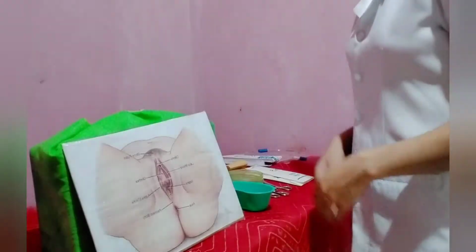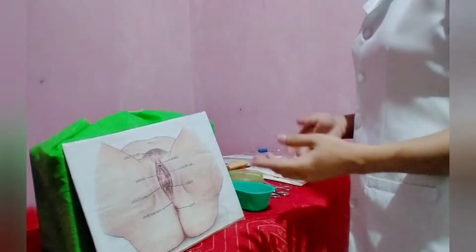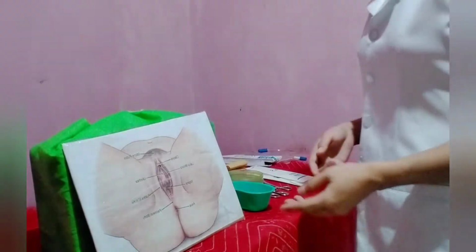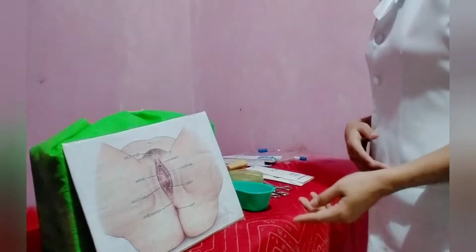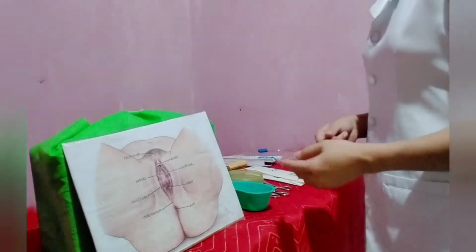After that, you have to apply direct light for visualization of the genital area. This is for better visualization. After that, you have to open the tray and arrange the equipment for convenience and accordingly to avoid any contamination. This is to maintain the sterility of the equipment.